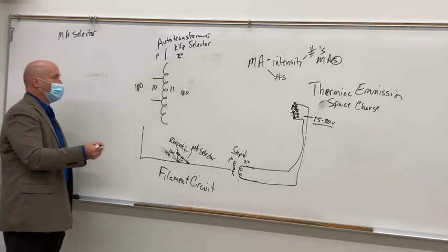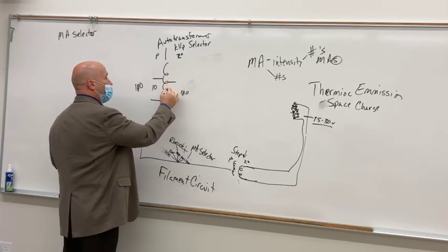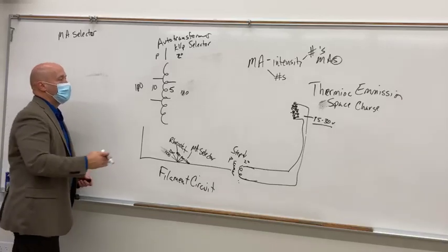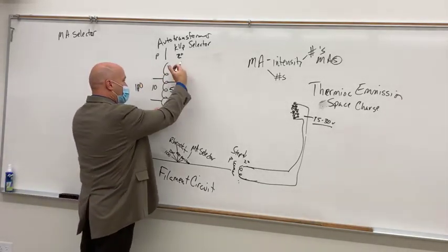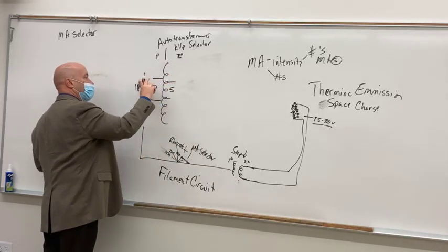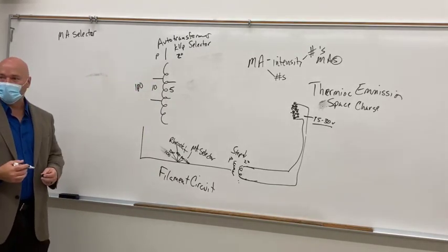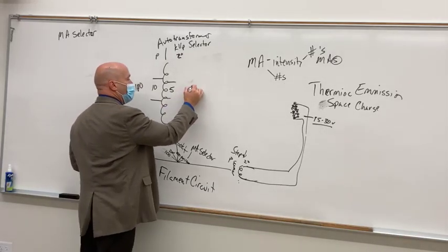Then what you might do is squeeze this down to where you have half of the turns on the secondary side than what you had on the primary side. The only thing that you did was squeeze those in. So you have half here compared to what you have there. So what is your voltage change? It's 50, right? So we got 50 volts.